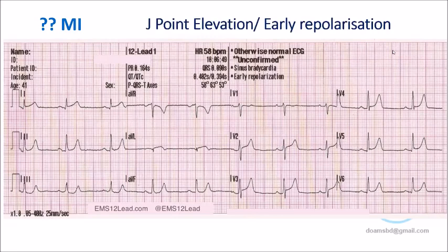How will we identify it, doctor? By the angle. Yes, by angle. Very good word. There is an angle, almost. But in coved-up ST elevation, there will be no angle at all. Confidently, we can say that there is no angle.